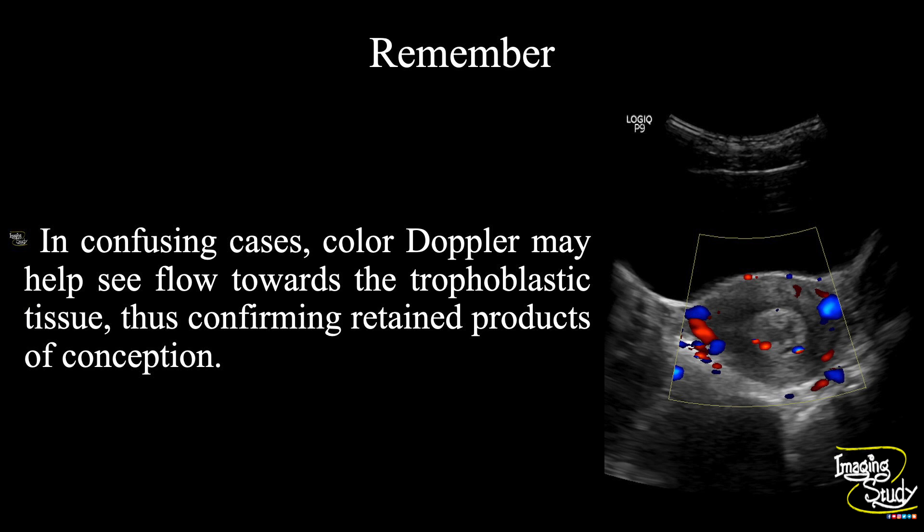The take-home message: in confusing cases, color Doppler may help by showing flow towards the trophoblastic tissue, thus confirming retained products of conception.